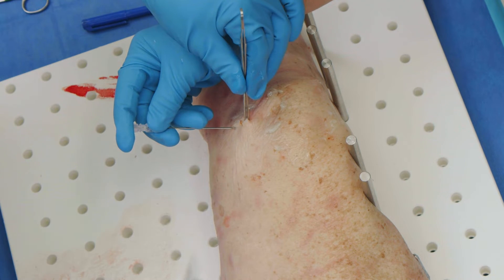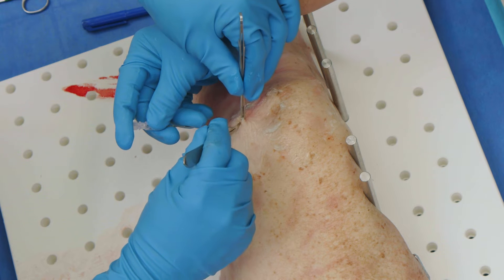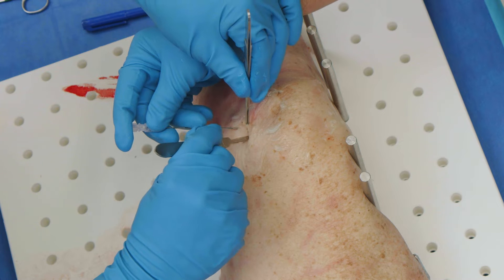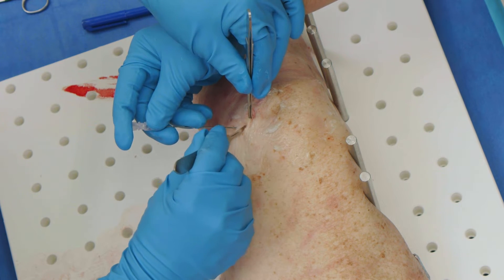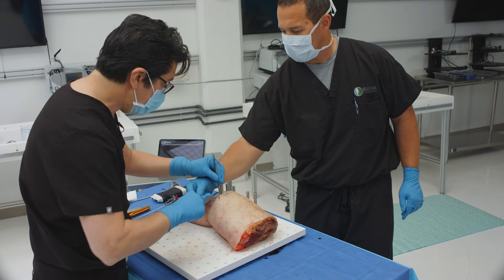I'm going to open this up and get down to the area. I'm making a larger incision than I normally would — normally it's only about a centimeter, centimeter and a half — but I'm making this about two centimeters so I can see well down there.